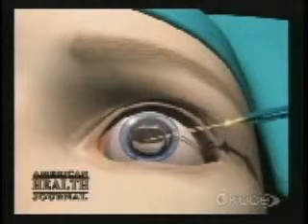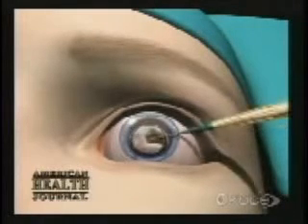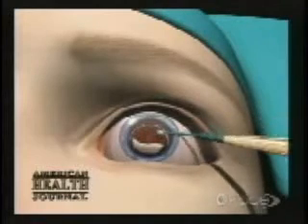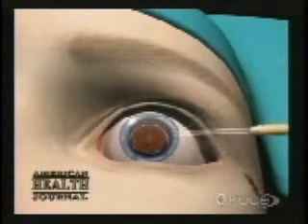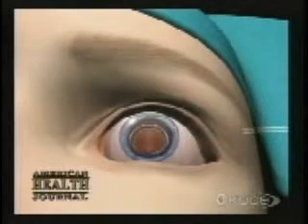Through the small opening, a capsule is opened up, and the lens, which is residing within that capsule, is vacuumed out. The lens implant is then inserted. It's a foldable lens implant, inserted in the eye, and it unfolds gracefully within the eye.